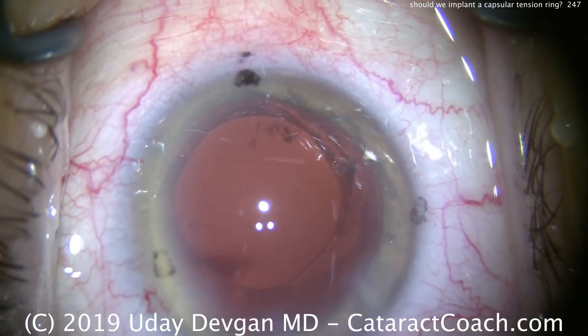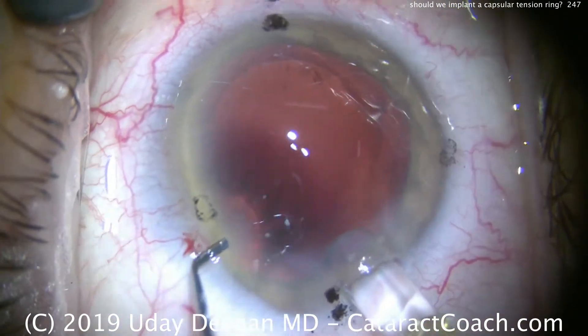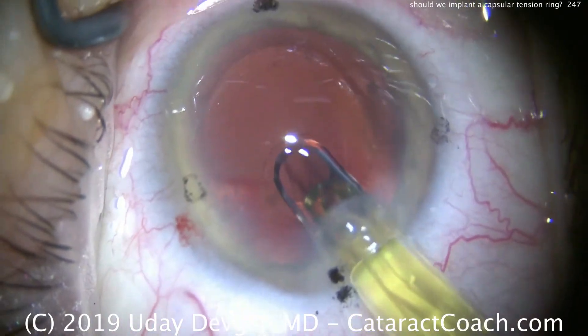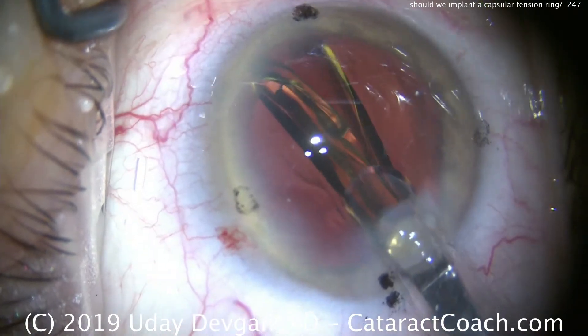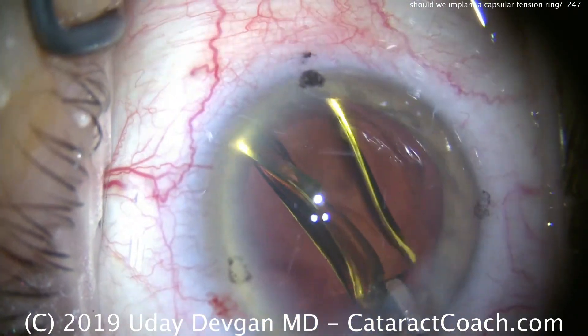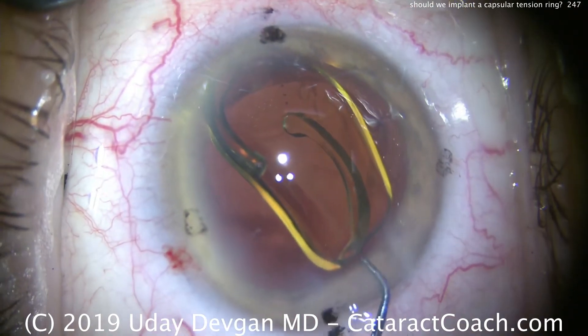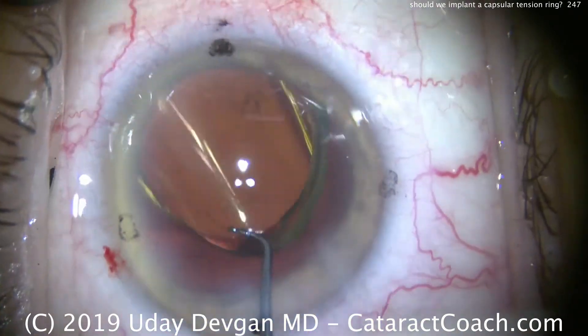We're now going to implant the IOL. The lens is a single-piece acrylic lens; we're going to place it in the capsular bag. You can put other lenses if you want — a three-piece lens, a sulcus lens. But let's look at this case: we've got a single-piece acrylic lens going in the capsular bag, nice and easy. You'll notice this is a toric lens — this patient has a high degree of corneal astigmatism, and the toric lens is important in that regard.